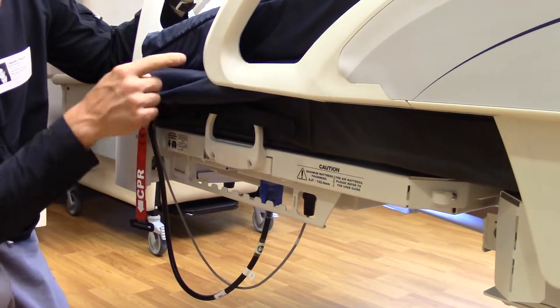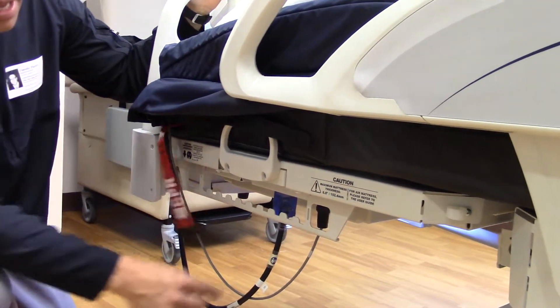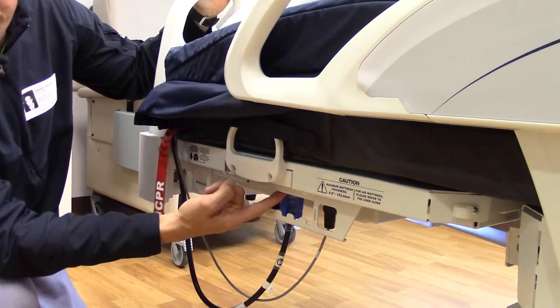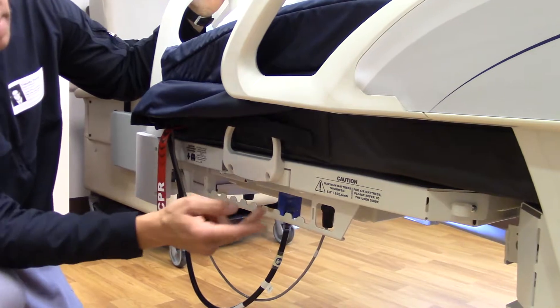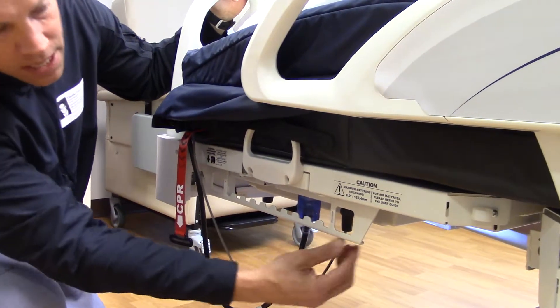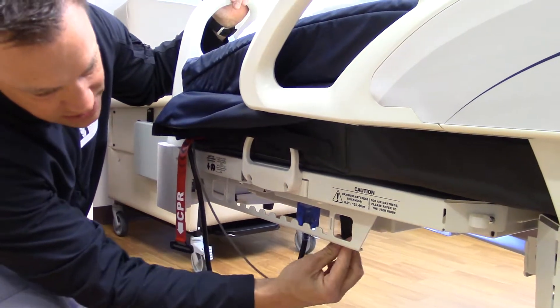The gray cord here allows the mattress to communicate to the frame and vice versa. This bed power cord should always be plugged into the single outlet — it's actually different than the other receptacle. So you always want to have your bed plugged in right next to the communication cable, and make sure that communication cable is nice and tight.